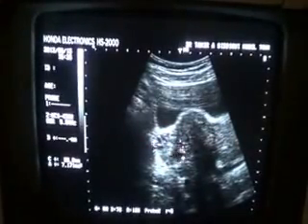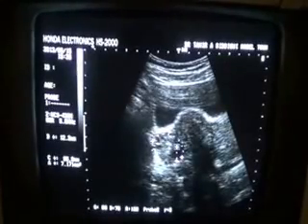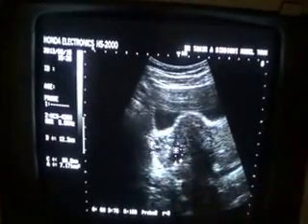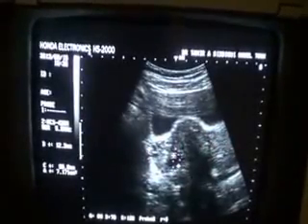This is the developing follicle in this cycle. This one, 12.3 millimeters. This is the ovary. These are the tiny follicles. So we have to save this ovary. This is a case of pyosalpinx, left side. Thank you.